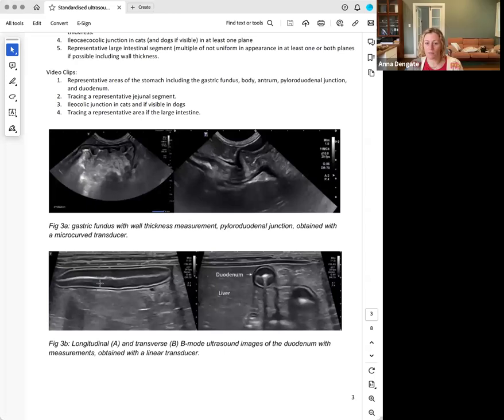So what we're seeing is the lymphatic vessels absorbing the fat from the meal. So if they've just eaten, it's a variant of normal. So not always significant. And often we're scanning dogs and cats that have altered transit times. So it might not be that they've just had a meal. It might be that their meal just left their stomach and hit their intestine. So if there's still stuff in the stomach, then I'd probably say, okay, may not be significant.